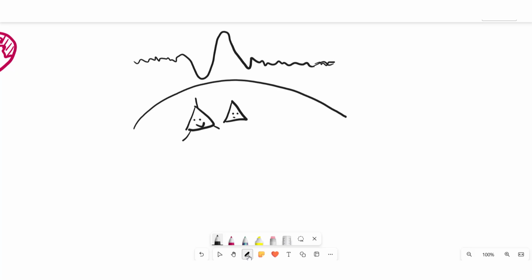These are pyramidal neurons in the cortex, specifically in the frontal regions. We have lots of happy pyramidal neurons. So let's suppose that we start with the surface EEG and then go down into the cortex to see where these shapes come from.